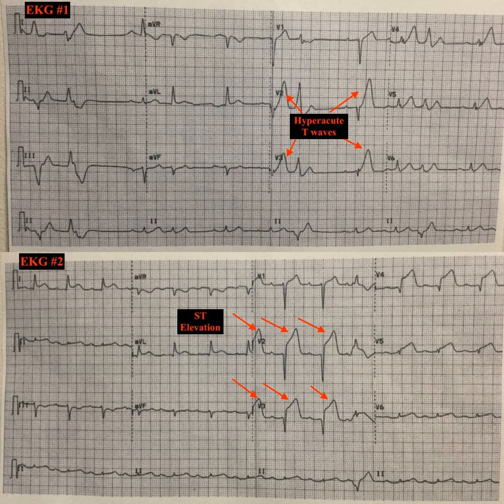Okay. And then you start to see Q waves. Q waves can come on as soon as the ST elevations start arising. And then over the course of a day or two, the T waves flip. And then after a few days, the T waves normalize. The only persisting finding from the STEMI is generally a Q wave.